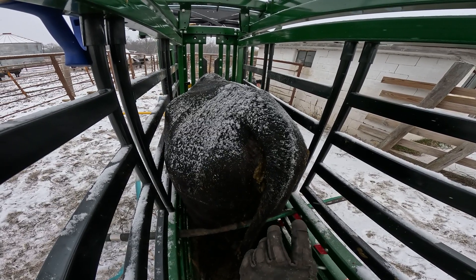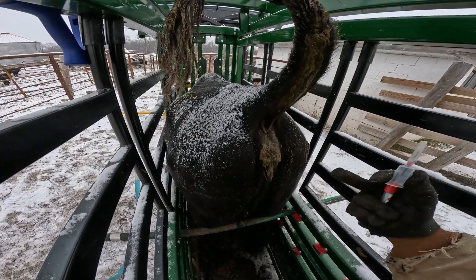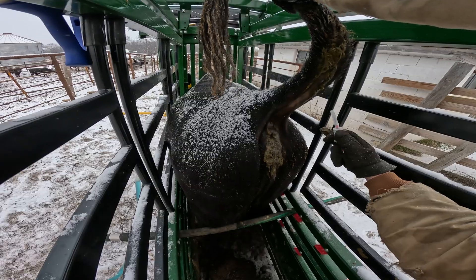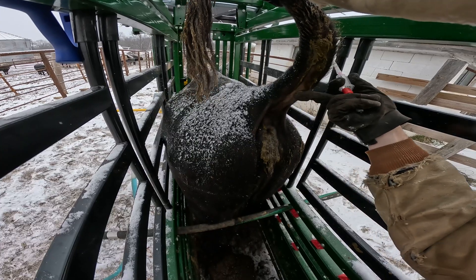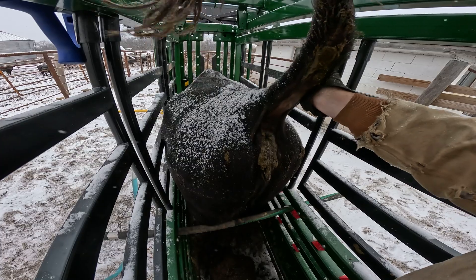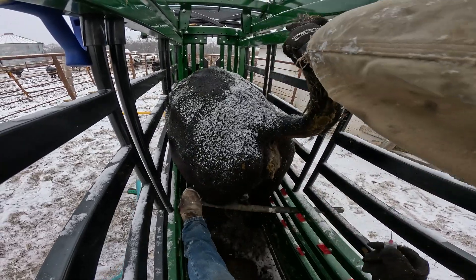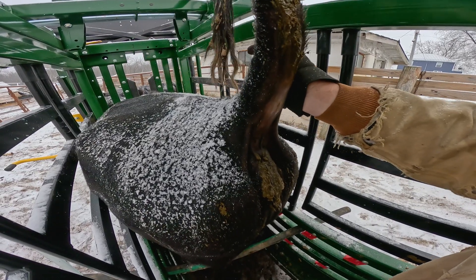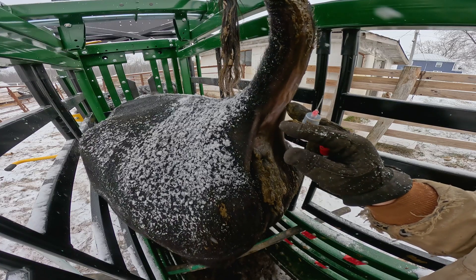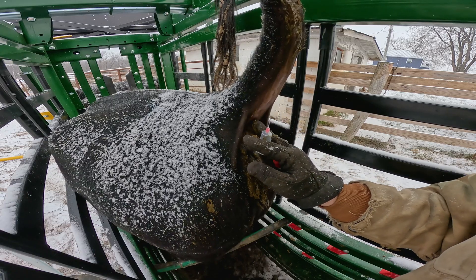We're looking at the back of number 23 here. She's been waiting very patiently but she's been freshly excrementing, so we're going to lift her tail straight up. Oftentimes it will be dirty back here — if you've got something to wipe it down with, a towel or whatever, use it. I'll just use my finger, put that back down. Makes it much more clean and reduces the chance for infection. It's not exactly the most sterile thing using my glove — like I said, I'm not a vet — but to me, it works. One important thing: make sure the tail is pointed straight up. They say to go two inches up from the base of the tail. There's a dip in the center of the tail right here — I believe this is a vertebrae. You don't want to stab the vertebrae, so I like to go right in between those two.